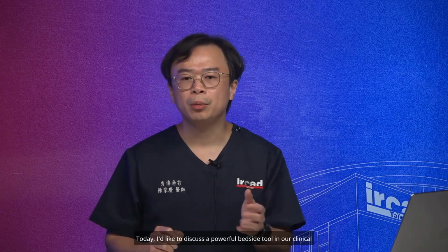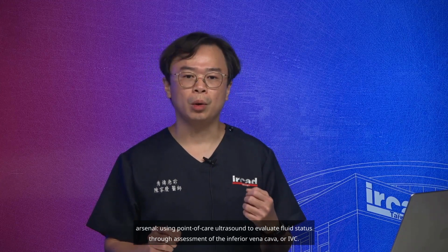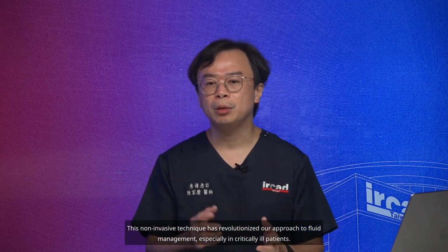Good morning, colleagues. Today I'd like to discuss a powerful bedside tool in our clinical arsenal, using point-of-care ultrasound to evaluate fluid status through assessment of the inferior vena cava, or IVC. This non-invasive technique has revolutionized our approach to fluid management, especially in critically ill patients.